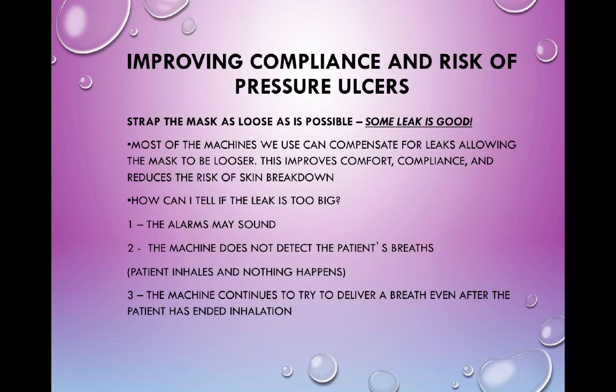They come into our emergency department, we stick them on 12/5. So they need 12 centimeters of water pressure, open their airway at home. But then they come in here, we're going to put them on 5. So what that'll look like, it'll look like they can't trigger. You'll see their chest moving, and nothing's happening. It's not going to actually deliver a breath, because they're still obstructing. So that's one caveat to that.